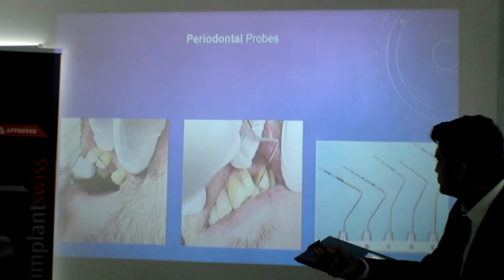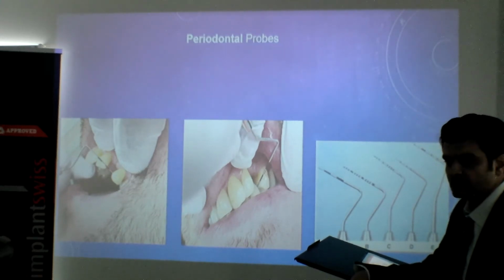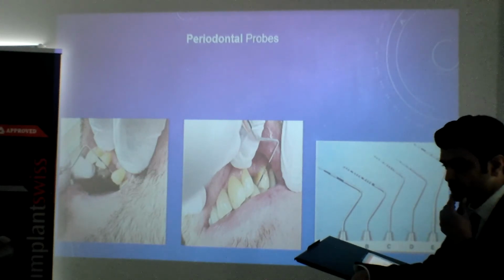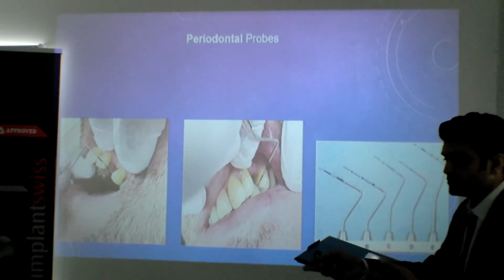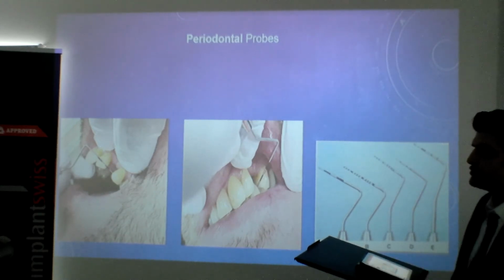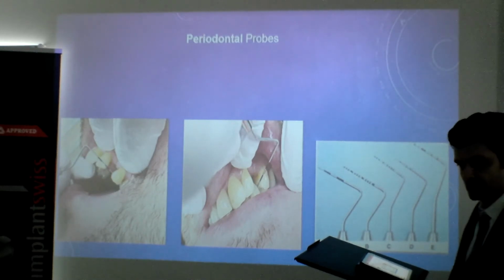Now, when you're looking at the photographs, you may start thinking, well, there's some wear on the central incisors. What about the guidance? How's the anterior guidance? You should have had a full set of photographs. What would a full set include? For implants, we talk about a single or two-unit implant, but a full set is still needed. Photographs are easy as long as the patient is compliant, in contrast to X-rays and radiation. So how many photographs would you need so that you can make a good assessment and plan the treatment?